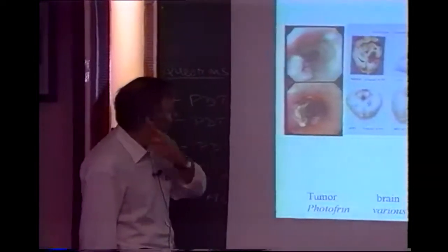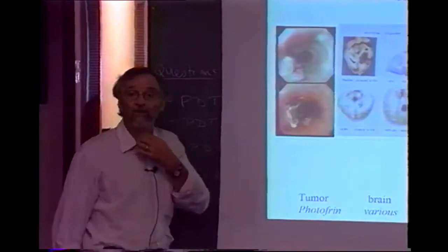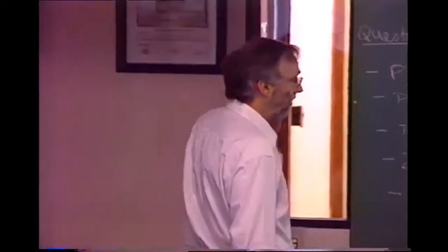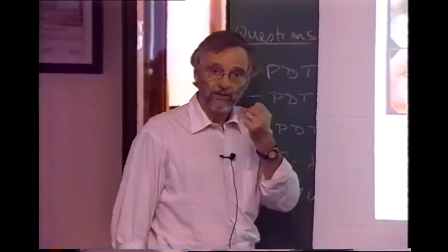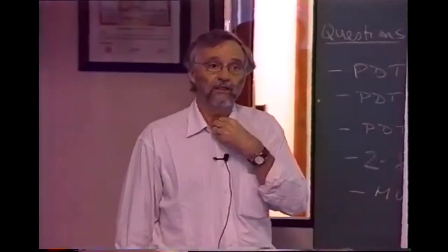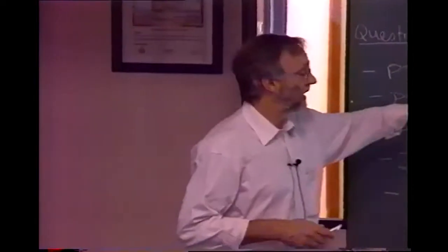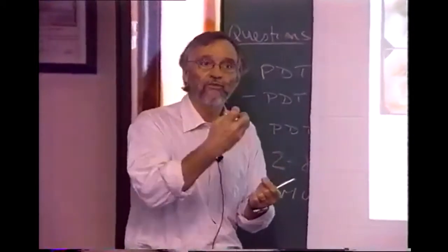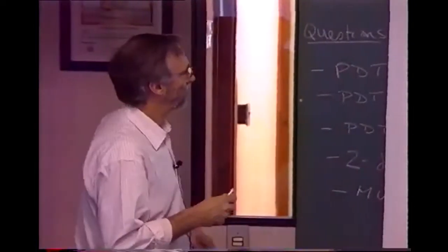Actually, just as a clinical comment, in the 1980s when people first started doing this for lung, a couple of people, well, one person at least was killed, a patient, because it was not realized that you produce this hard necrotic mass for a few days, and in the lung that actually blocked breathing. So now for lung PDT like this, you do the treatment, and the next day go in and remove the dead tissue. It's called a toilet bronchoscopy.